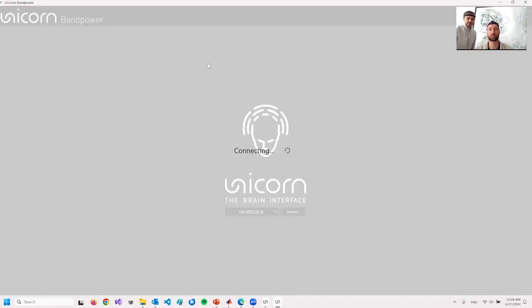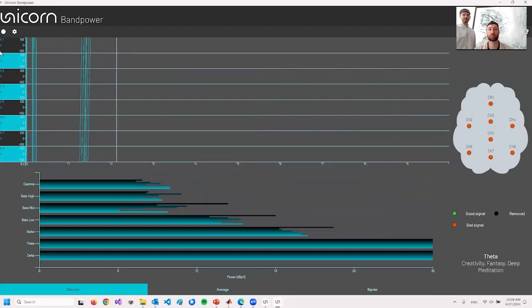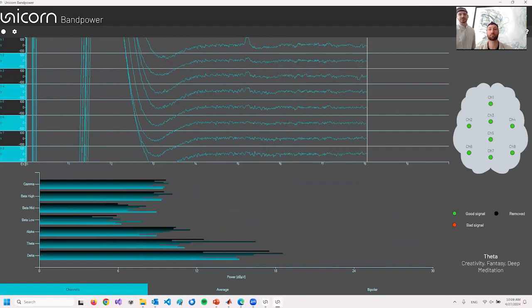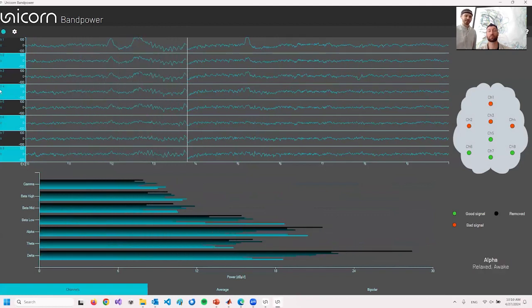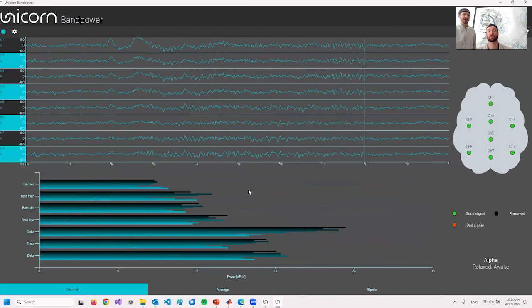And if you've finished with your setup, you just go back to the main dialog and you can record and stream data. You can see that there's this Wi-Fi item on the top right that indicates if you're streaming data or not. You can also record band power data by pressing the record button. Then whatever you see in the UI is also written to a CSV file.